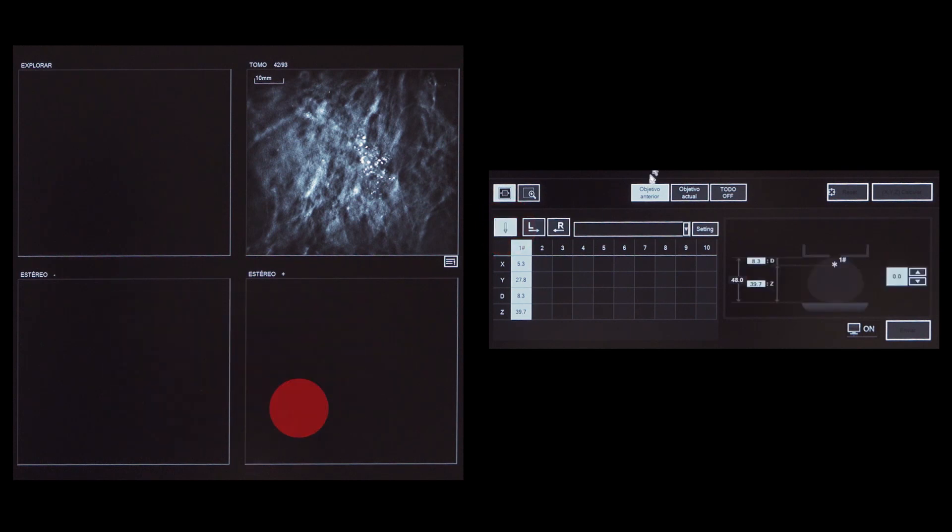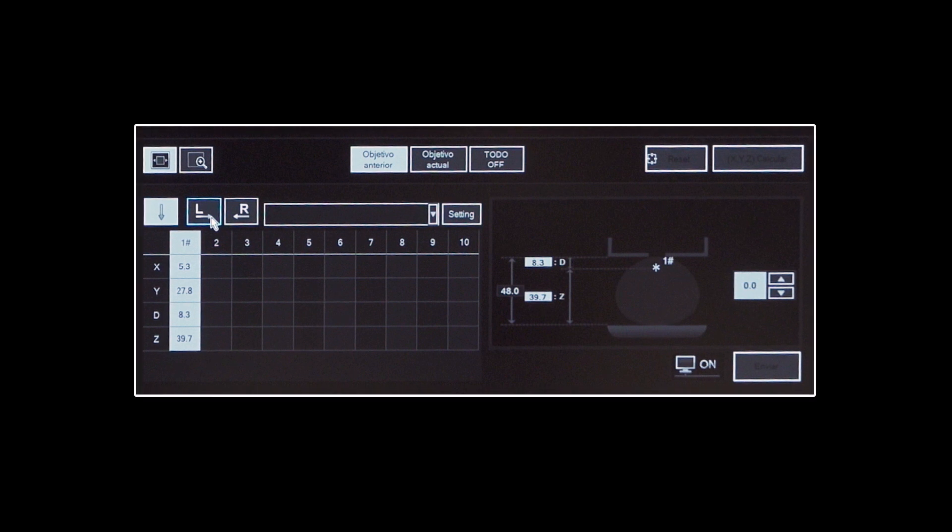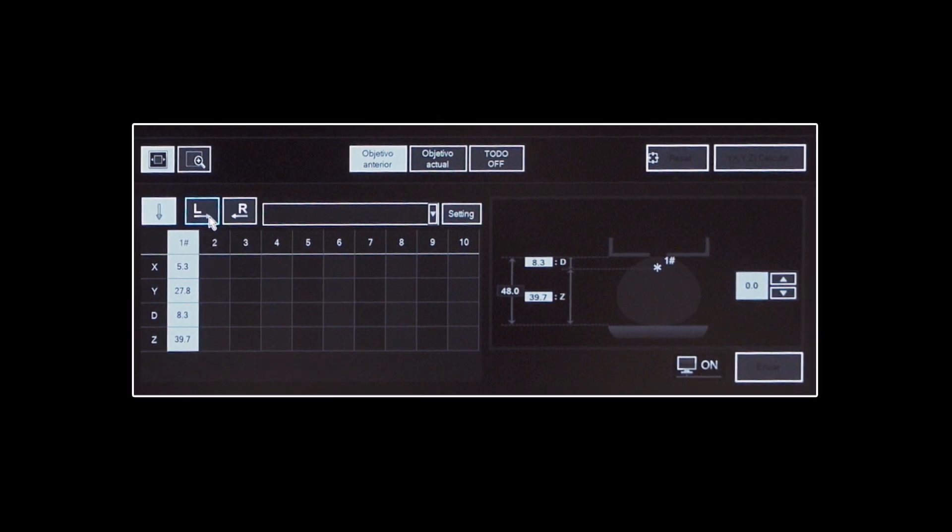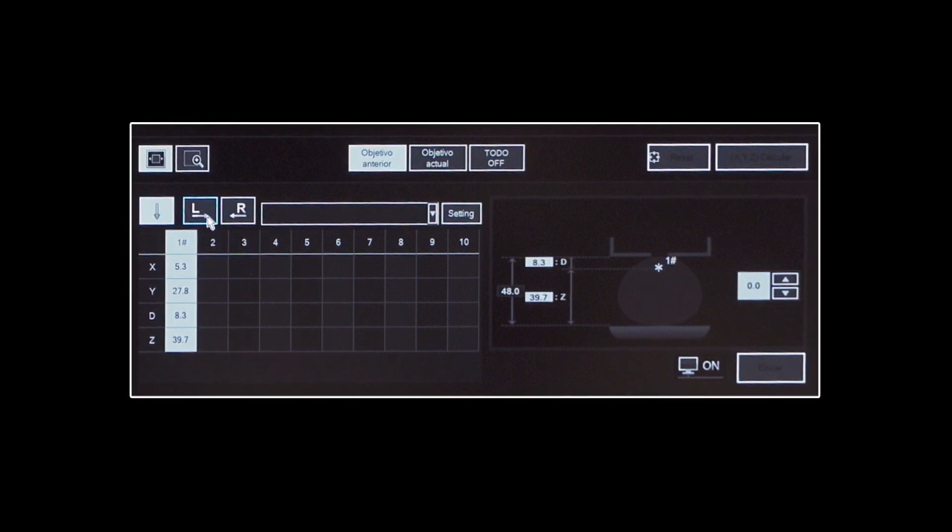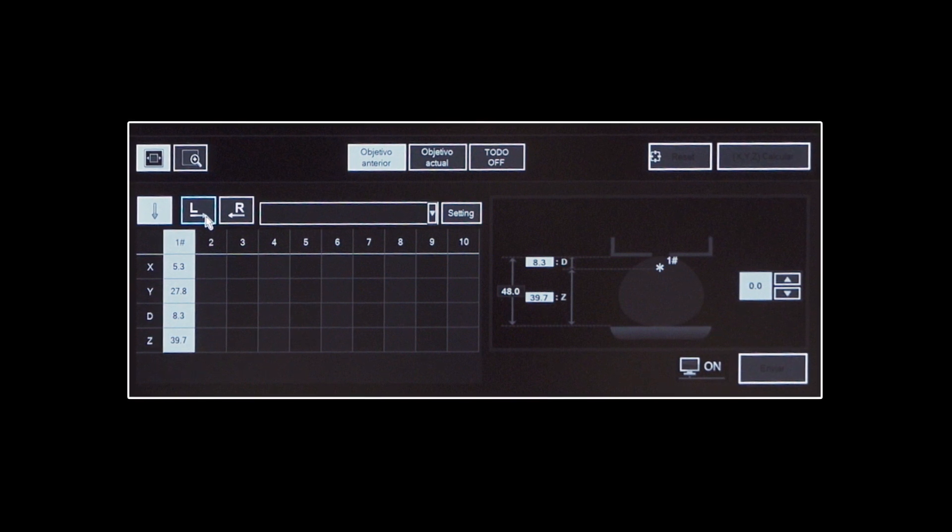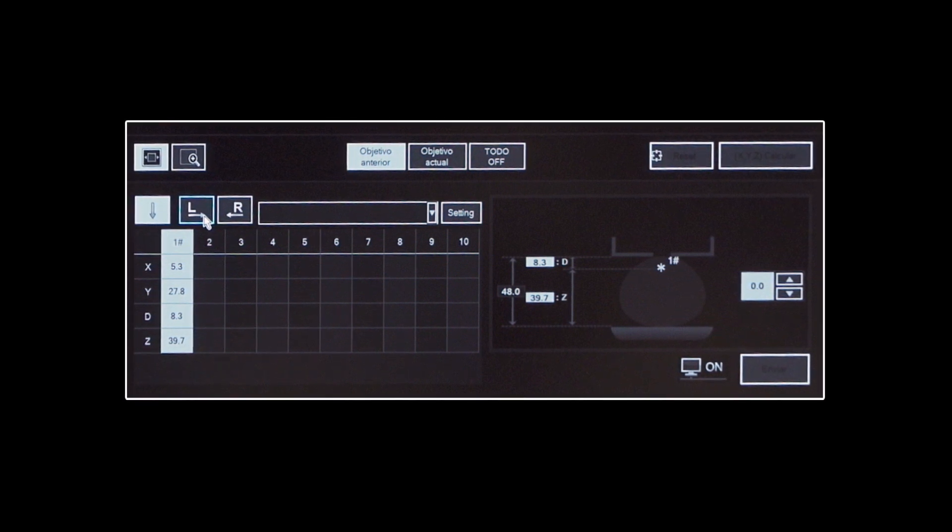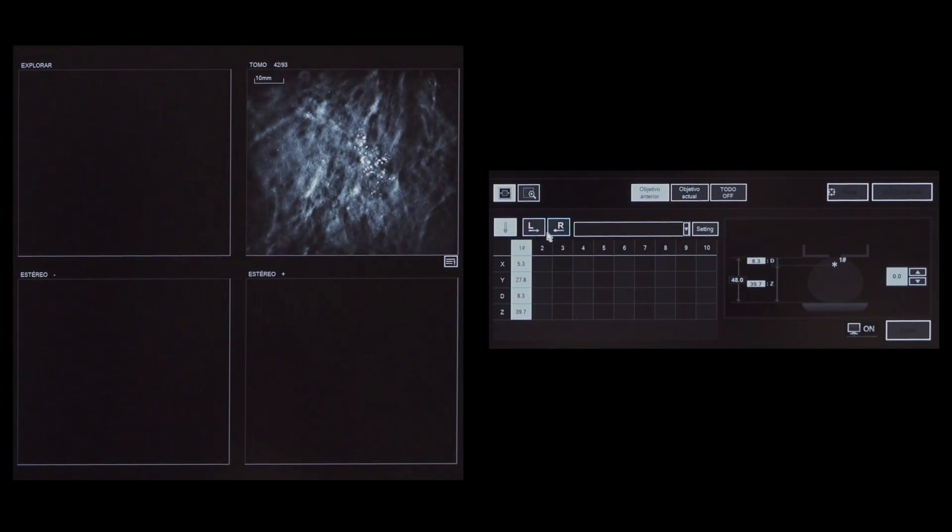Confirm vertical approach. Observe the breast pictogram indications: breast thickness, target distance to breast support and skin, as well as the target coordinates X, Y and Z. Select the NCORE 113 full notch 10G needle and confirm needle values. Click the send button to send coordinates and needle characteristics to the biopsy positioner.